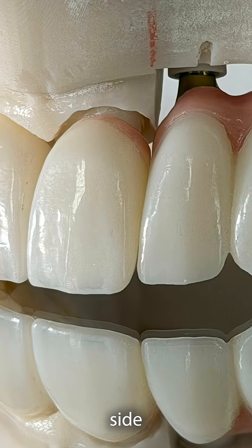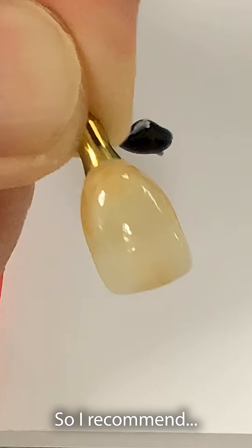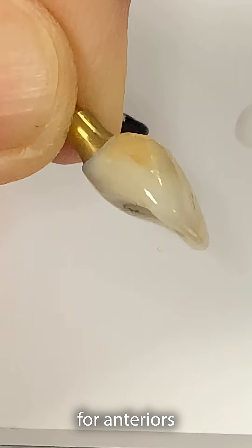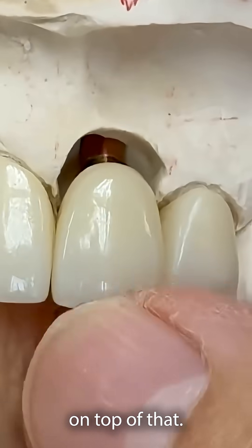Whenever we see the tissue size, we have to look at the margin and the CEJ. I highly recommend implant provisionals for anteriors all the time, because we can see if the tissue level is lower, then we can cut it and make the custom abutment on top of that.